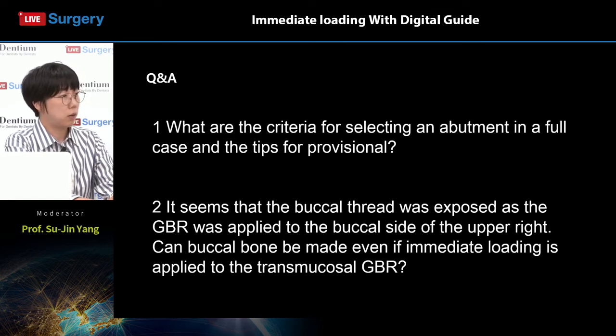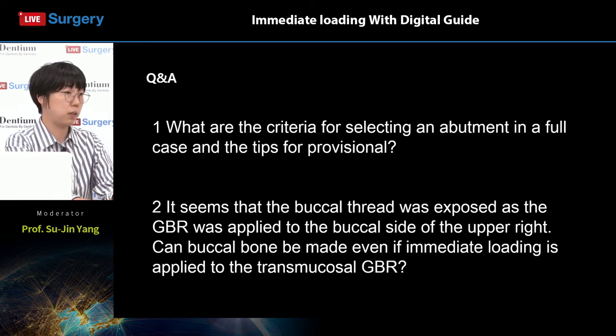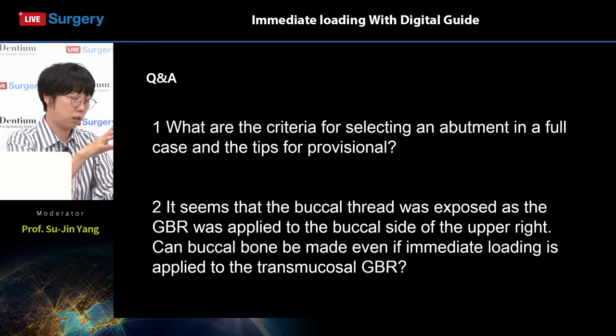But just to think about it, even in transmucosal GBR cases with immediate loading, the most important factor for GBR outcome is that your flap is immobilized, so your flap doesn't move around. And in cases where only the buccal bone is added, as long as the flap is secured firmly to the buccal side of your implants, then the provisional itself or the loading itself won't actually cause much mobilization to the graft material. That is, if you had enough initial stability on your implants. But thinking backward, since you have enough initial stability, then you could place your provisionals in the first place. So we wouldn't have to worry about that.